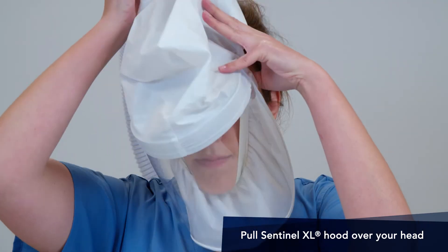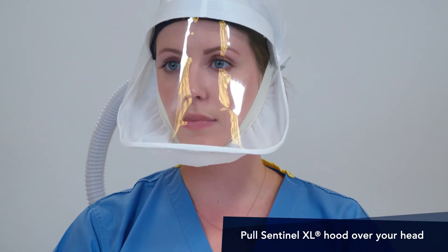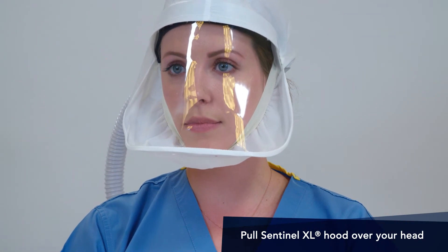Don the head cover and adjust the hood if necessary. The padded part of the head strap should be centered on your forehead. You're now protected and ready for action.